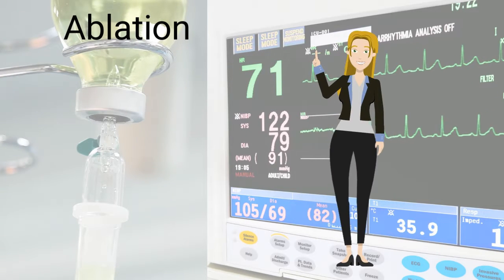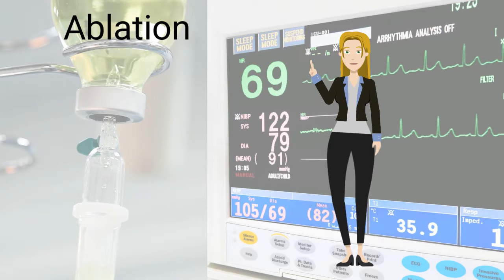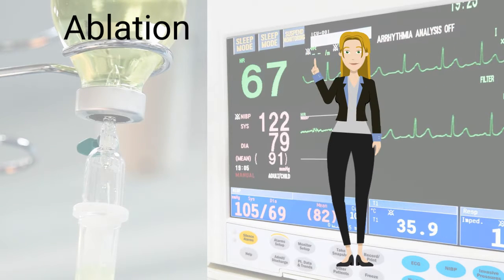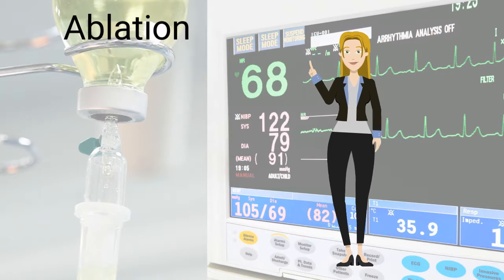Ablation can be performed during a cardiac catheterization to correct conditions that cause an abnormally fast heartbeat. Sometimes, the electrical signals in the heart may originate in the wrong part of the heart and follow the wrong pathway, causing the heart to beat too fast. An ablation can destroy the abnormal electrical pathways causing this abnormality.